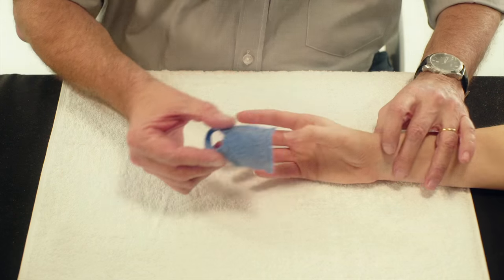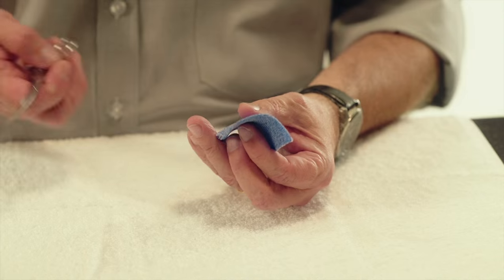Once cooled down, remove the orthosis and round the proximal edge of the orthosis.